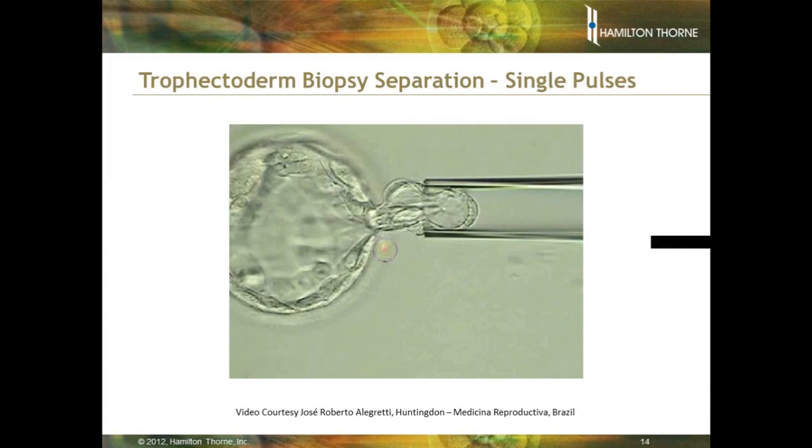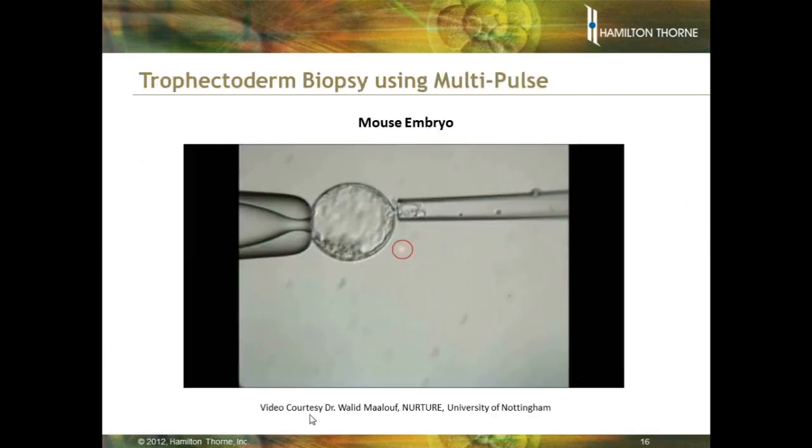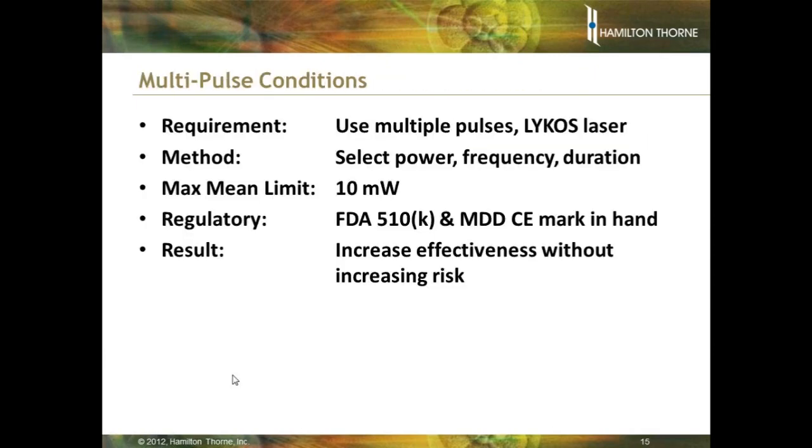Now, a second application of this is in working with trophectoderms. And if we can make this work, perhaps somebody would make that one.